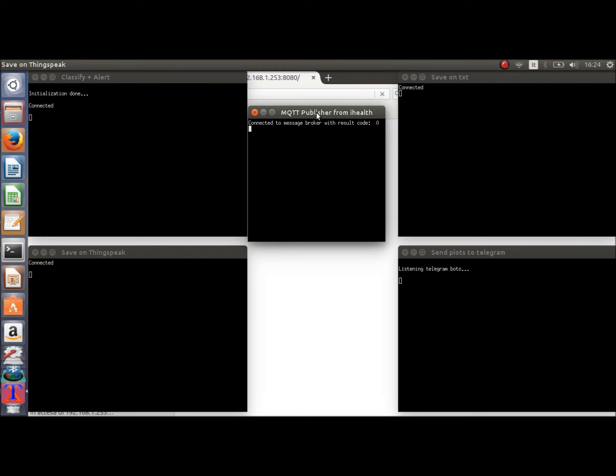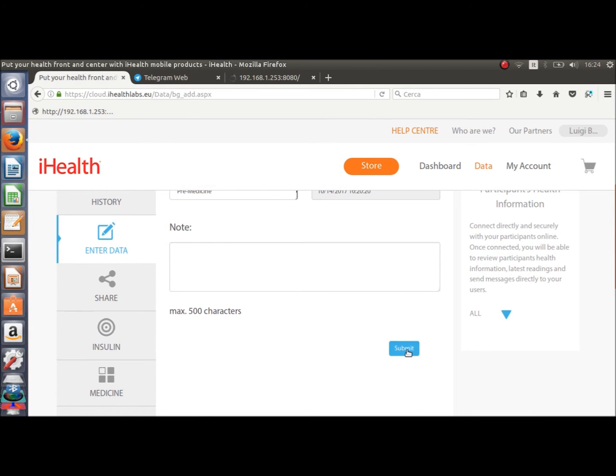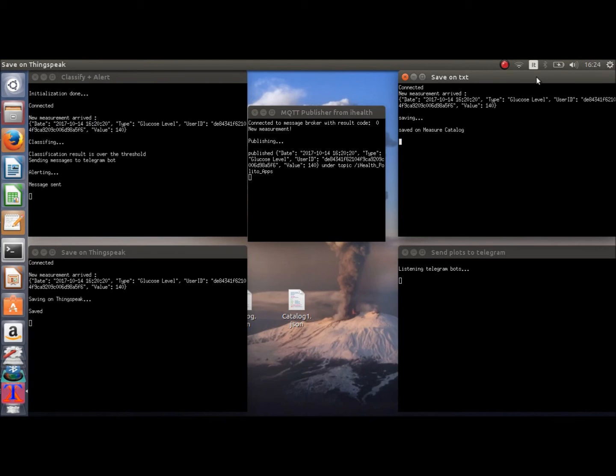Just to be faster, we can send measurements by using manual input on the iHealth website. We can, for example, send a blood glucose measurement. We write the measured value and we click on Submit. This account is associated with a user ID, so the program will do all the work under it. We submit the message and check if the microservices receive it. That's it. The save-on-txt microservice saves the measurement in the patient's measurements database, which is in JSON format, under the right patient name and kind of measure.